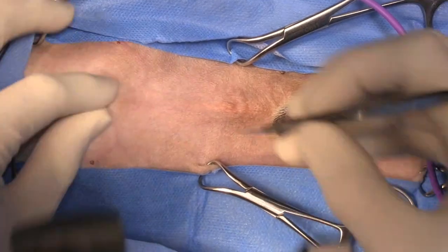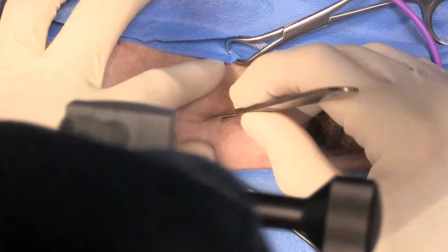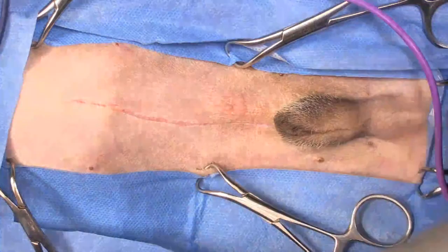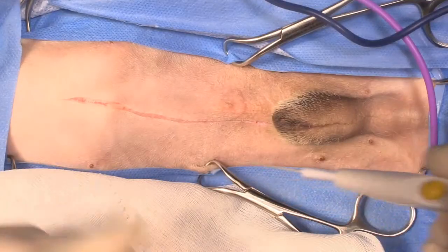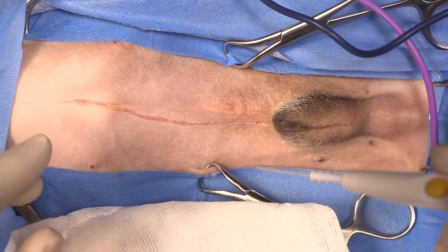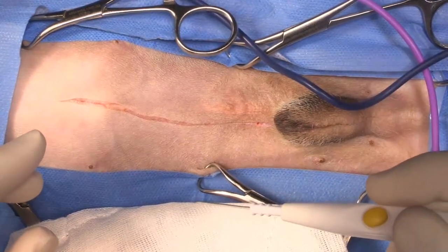Southpaws. We're just getting started on an exploratory laparotomy today on a little four-year-old Chihuahua Pomeranian cross that has a history of having had a CT scan. On the CT scan, they found a biliary mucocele and an incidental finding of an extrahepatic portosystemic shunt. Can I get the Bovie plugged in, please? So we are exploring the abdomen right now. We'll remove the gallbladder and we will put either a band or an ameroid constrictor on the portosystemic shunt.